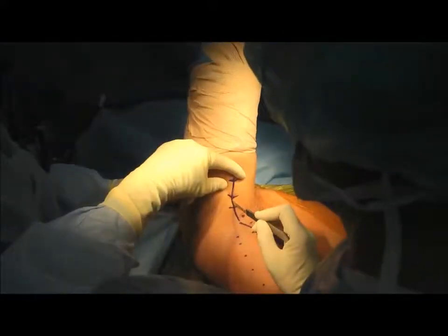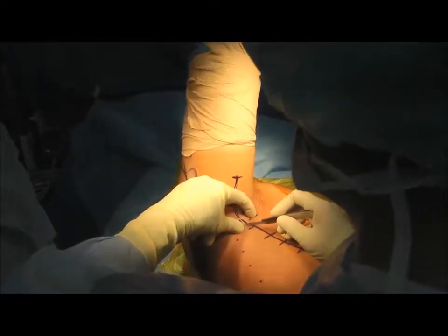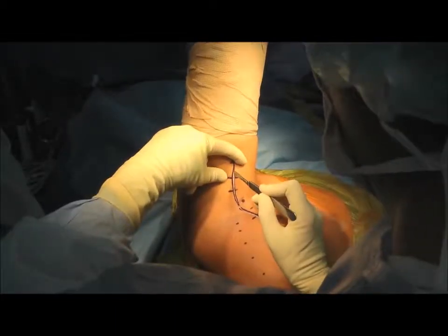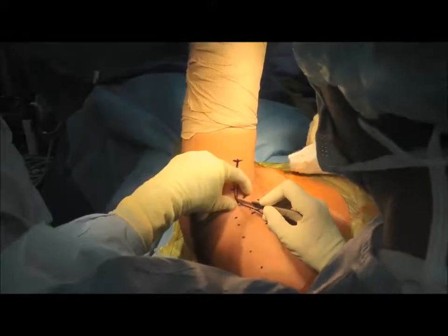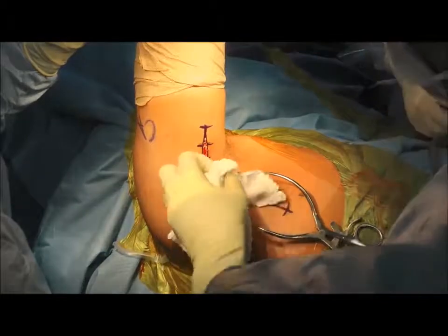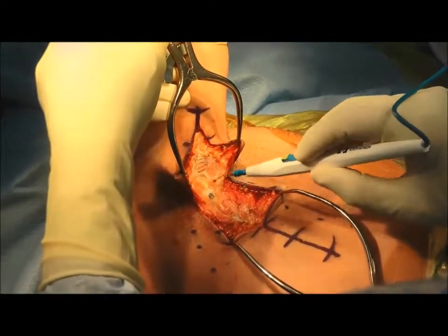A 6-8 cm incision is made along the posterior aspect of the axilla and is taken down to fascia. With this technique, the repair is done through one incision. The humeral aspect of the incision is for exposure of the humeral footprint of the latissimus and remains relatively constant, whereas the incision towards the flank is for exposure of the retracted tendon and can be extended as needed.